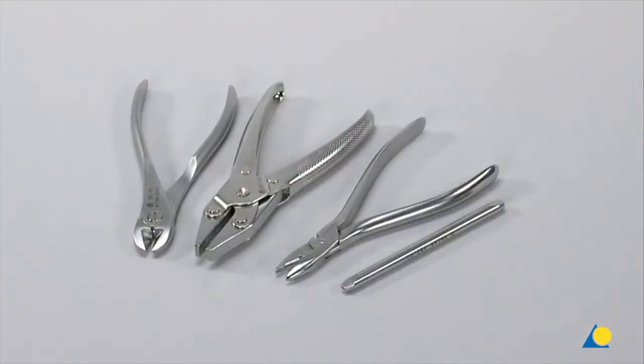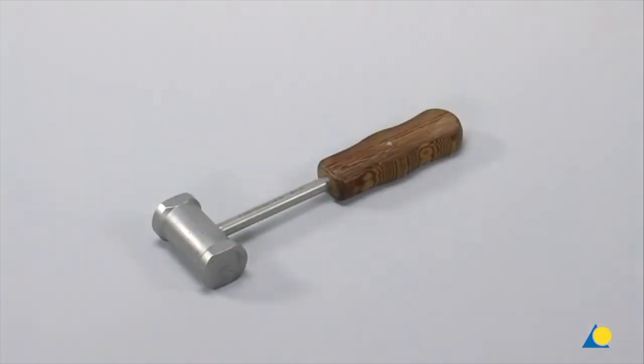Also needed are the small wire cutter, the flat-nosed parallel pliers, the wire bending pliers, the bending iron for K-wires, and the hammer.